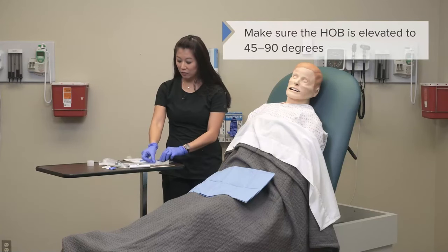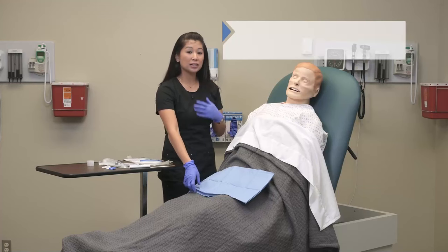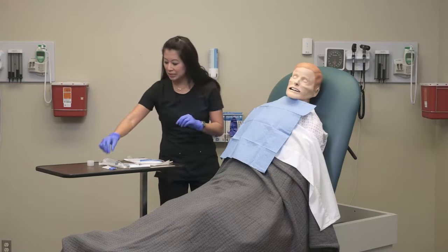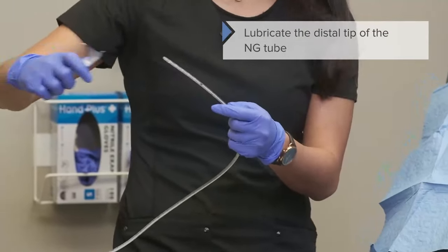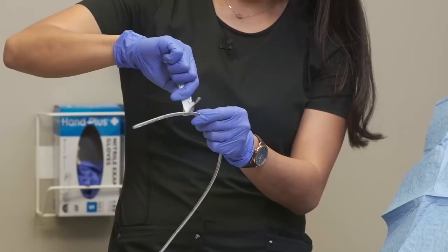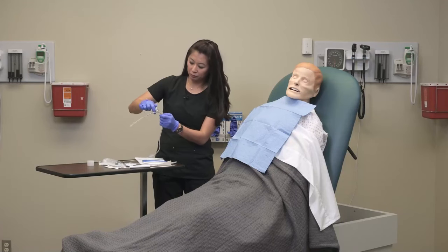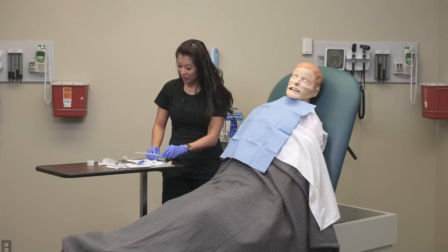I want to make sure my client is comfortable. Notice the patient's head of bed is up at least past 45 degrees — 90 degrees is even better if they can tolerate it. Because we're going down the nasal cavity and there will be secretions, I'm going to put an absorbent sheet over the patient so if they cough or sputter we don't get it on their gown. Now I'm going to prepare my equipment and lubricate the tip of my nasogastric tube. You may see a nurse stick the tube into the surgical lubricant, but I want to make sure this is really well lubricated to help for much easier advancement of the tube.